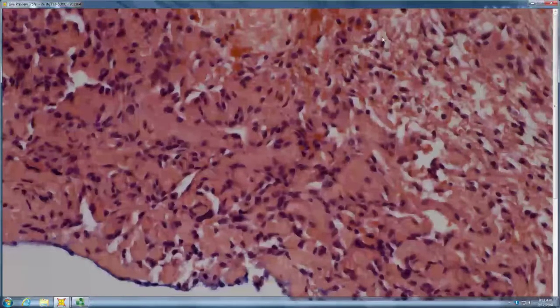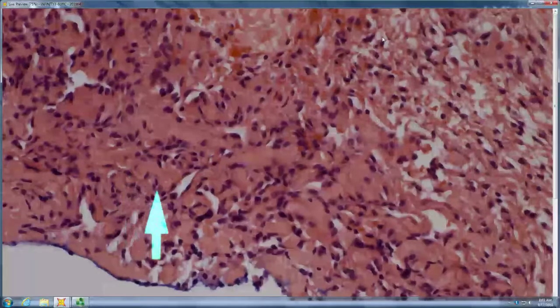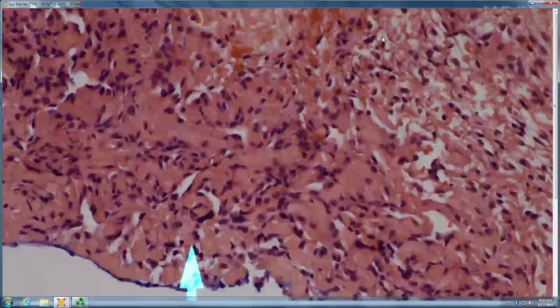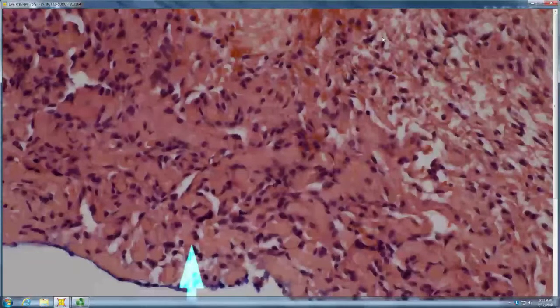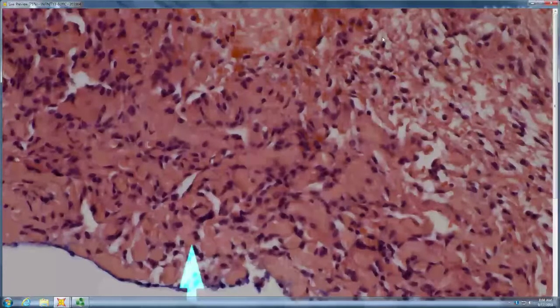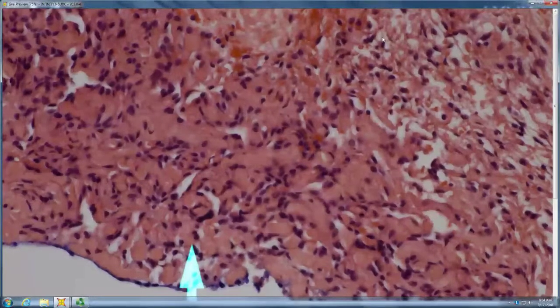Vascular-like spaces, tons of tiny little collagen balls, all of them wrapped by those blue cells. So what in a kid looks like aplasia cutis and has something underneath that looks like a vascular lesion with tons of tiny little collagen balls all wrapped by little blue cells? Anybody? Meningocele. So that's meningocele, or rudimentary meningocele on the scalp. Presents like aplasia cutis, vascular-like spaces in the dermis, each full of little collagen balls, all wrapped by the meningothelial cells.